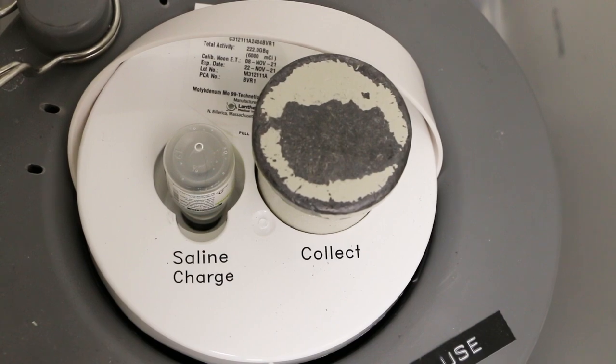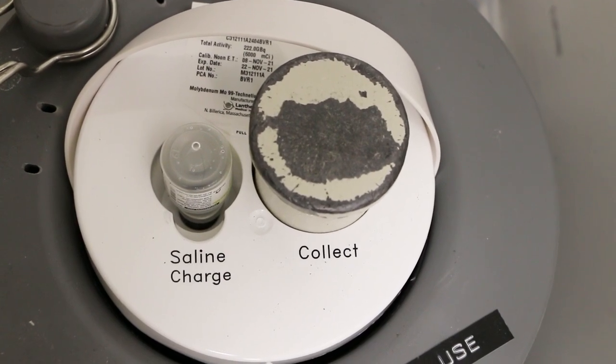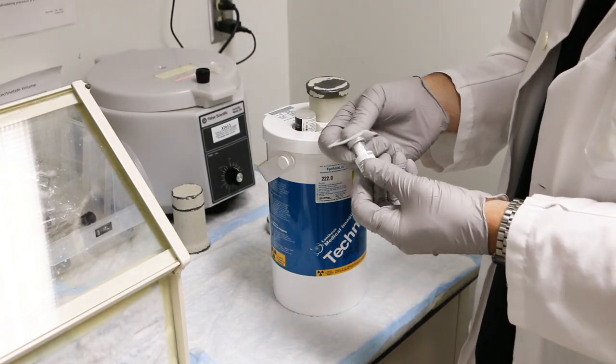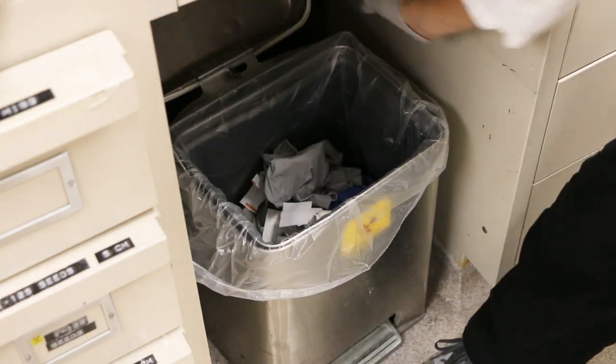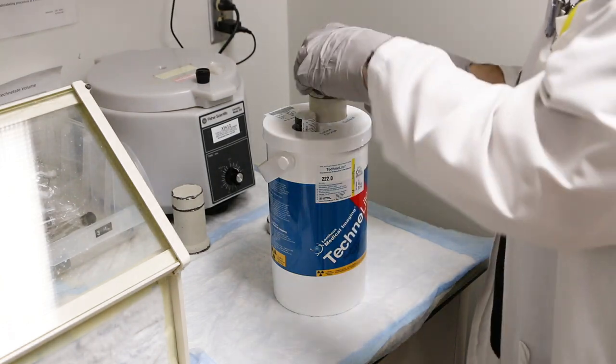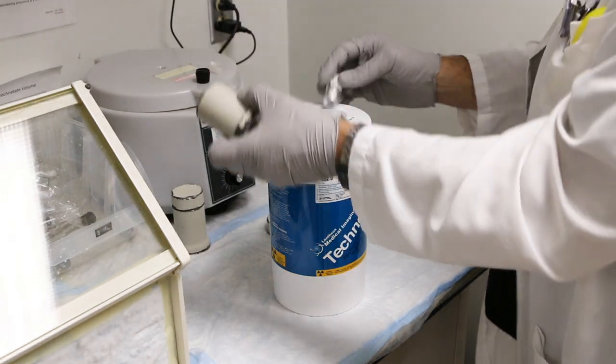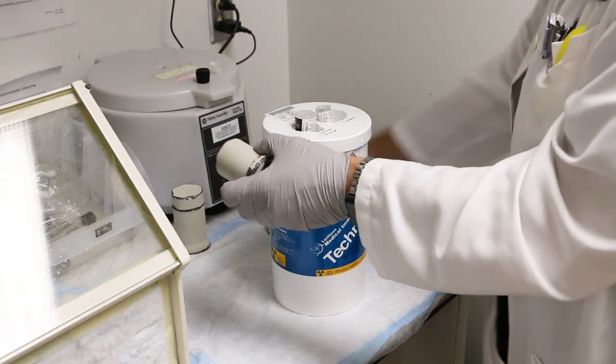You may notice the saline charge vial bubbling during the elution process. Before removing the collection vial, swab the needle seal vial with an alcohol wipe and discard the wipe in the hot trash. Replace the collection vial with the seal vial and quickly cap the collection vial.